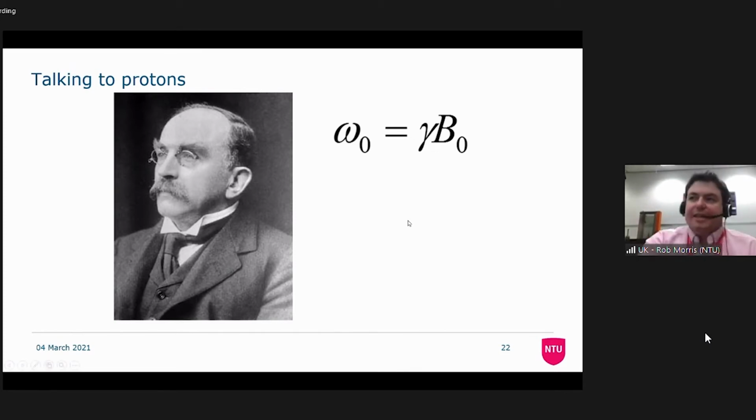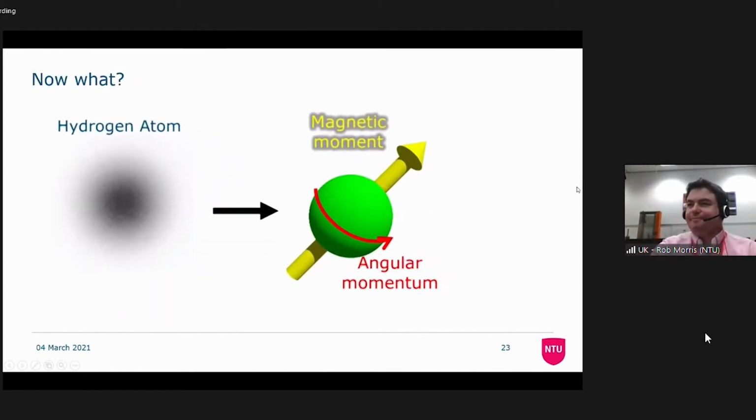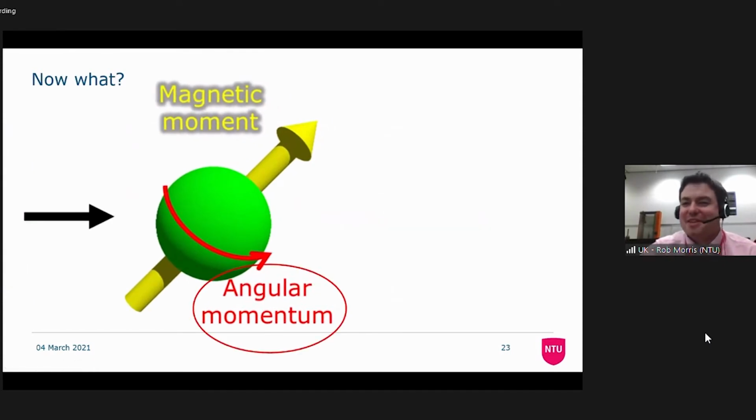Now, for most systems, that corresponds to a radio frequency, which is why we always talk about RF coils and these kind of things, but it's not necessarily the case that it is radio frequency. So we've got a couple of systems that work below radio frequency in the kilohertz range. They're a lot of fun in their own right because you can actually then hear the sound. So our Earth field scanner is really cool because the frequency range is within human hearing, so you can actually hear it boom as you get the signals, which is really neat. But for what we're going to talk about today, it's almost always radio frequency. Okay, we're nearly there through the same stuff as everybody else's.